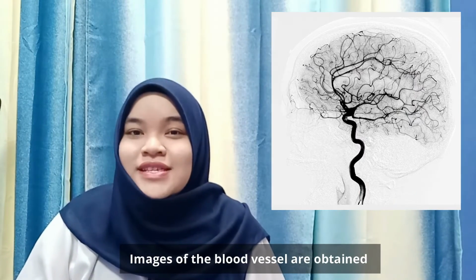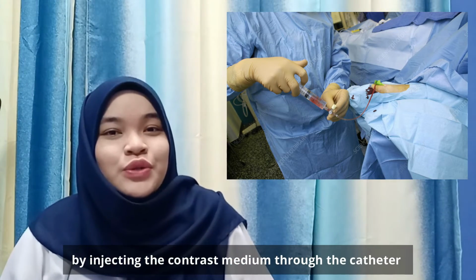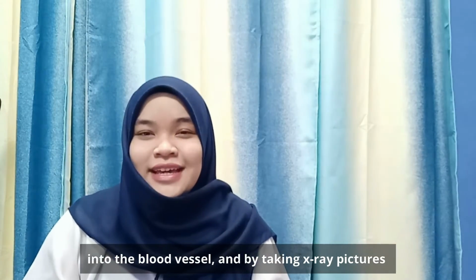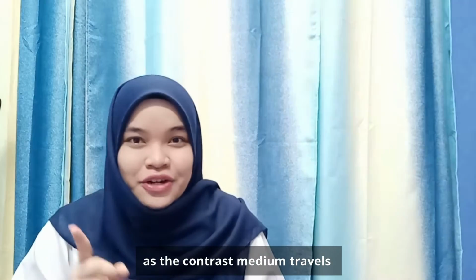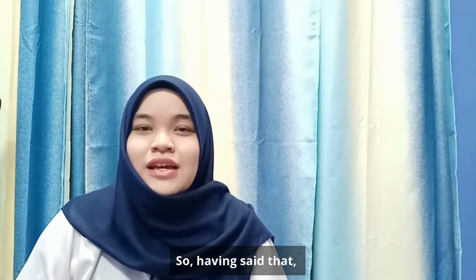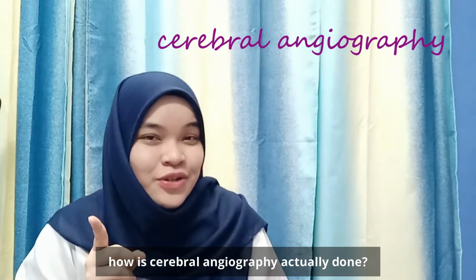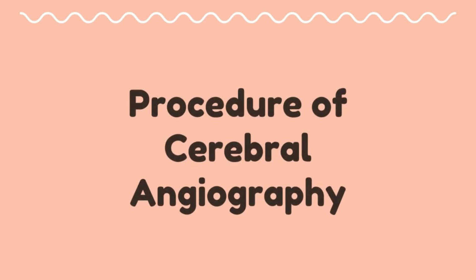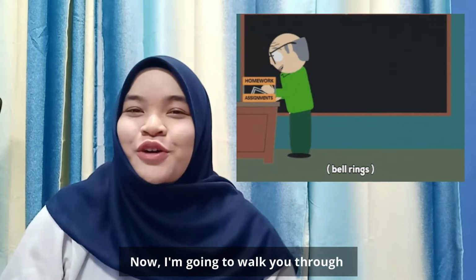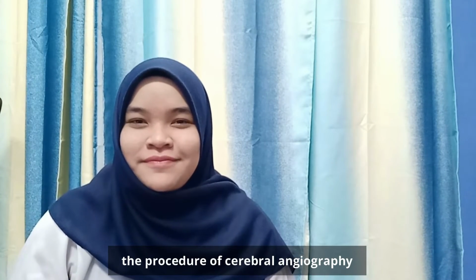Images of the blood vessel are obtained by injecting the contrast medium through the catheter into the blood vessel, and by taking X-ray pictures as the contrast medium travels through the arteries and veins. So, having said that, how is cerebral angiography actually done? Now, I'm going to walk you through the procedure of cerebral angiography.